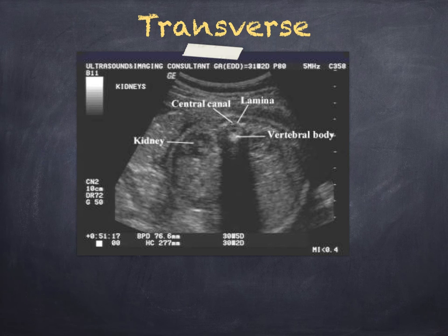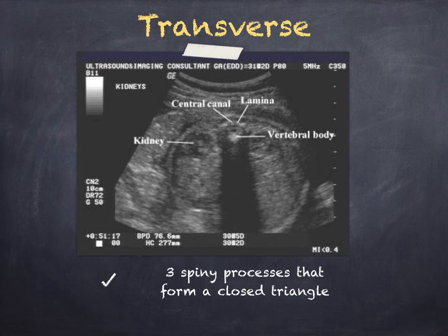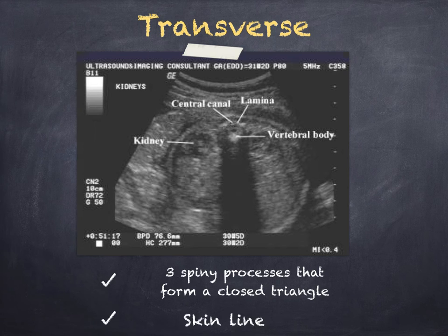Here's a simple example of the transverse view you're looking for. As you can see there are three spinous processes here that make that nice closed triangle, and the skin line is nicely demonstrated.